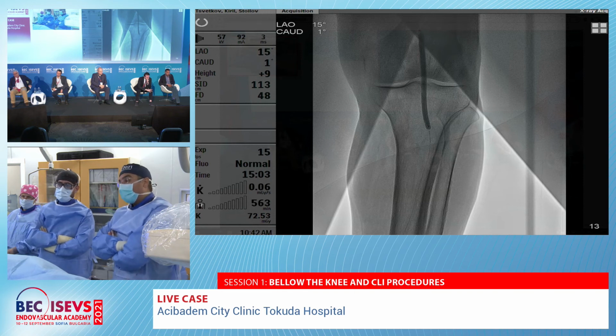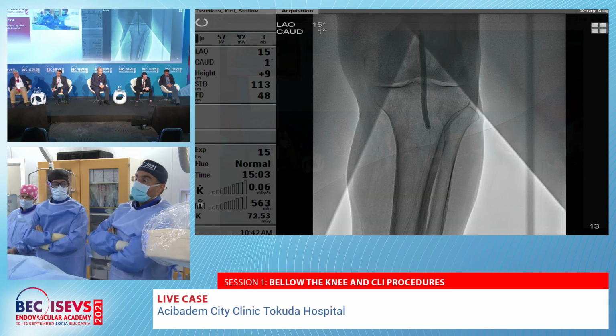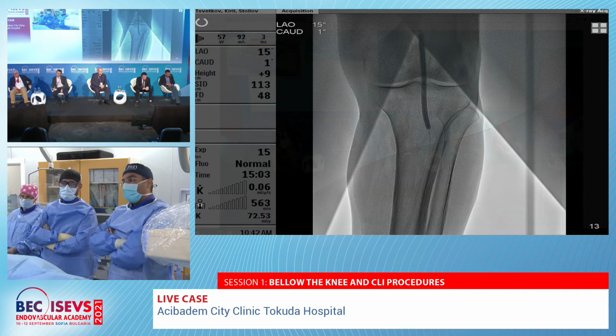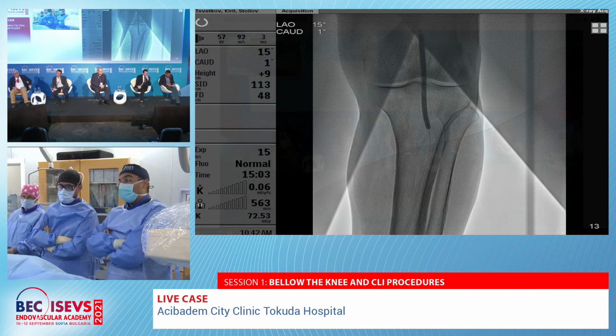In calcified lesions, and I'm talking about severely calcified lesions, you need either debulking or, let's say, a stent graft and a Supera, the so-called pave and crack. At the moment, in my personal experience, I have not seen any other method that works well in really calcified lesions.